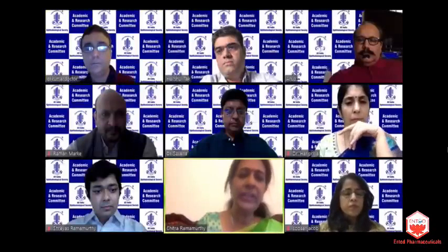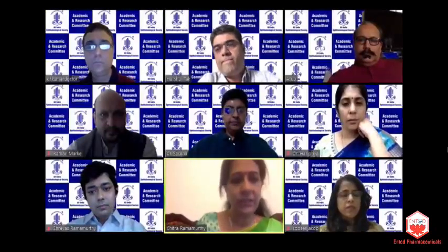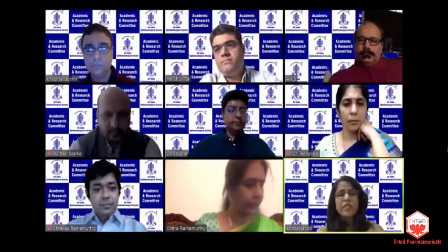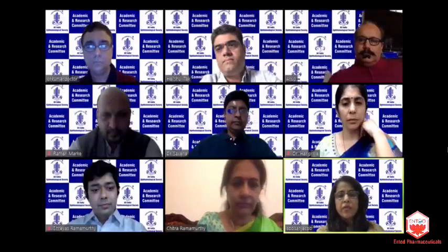Or do you have any other question regarding Kumar's case? Or do you think he has justified himself quite well? I think he's done a pretty good job there, managed it well. Flap motility sign is something that I would definitely pay a lot of attention to.